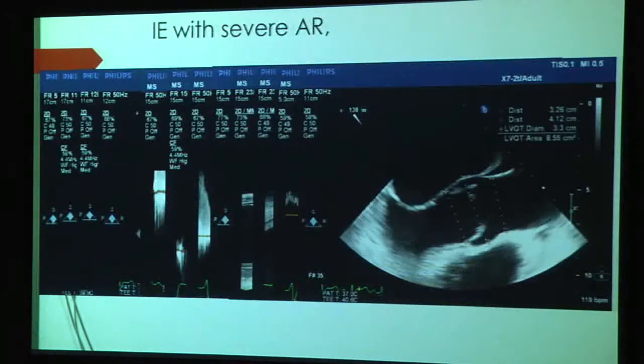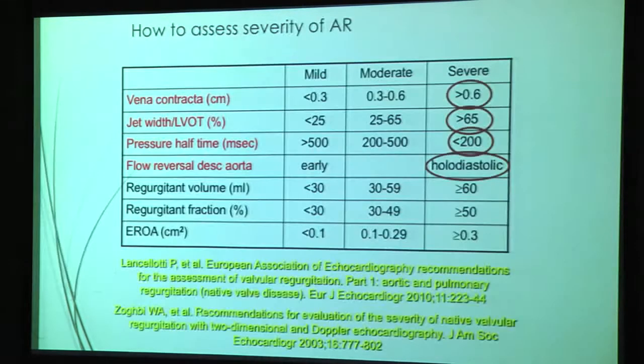And then we obviously need to do some measurements to give our surgeon an idea what sort of valve he needs to use, and the sizes of the LVOT as discussed before. So just a quick overview of the assessment of severity of AR.